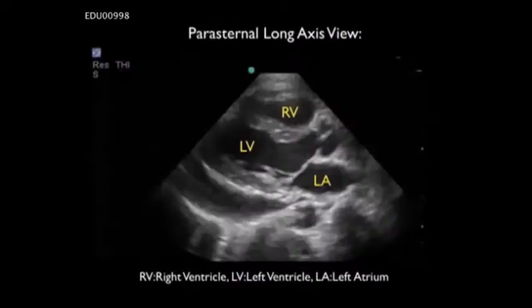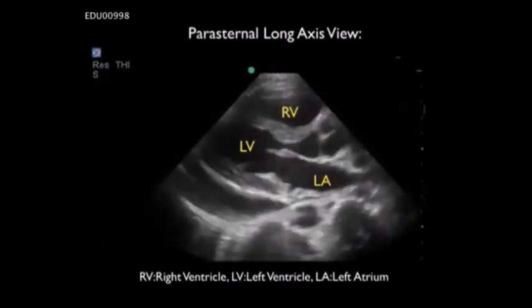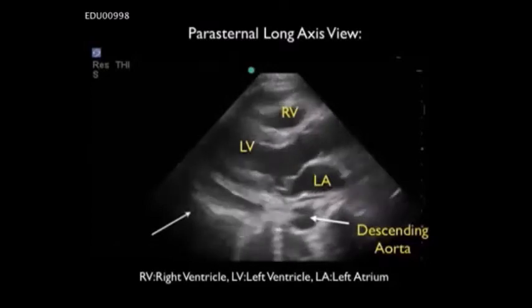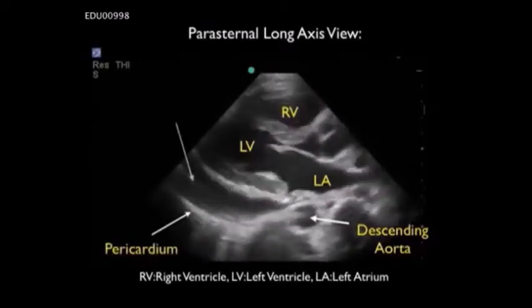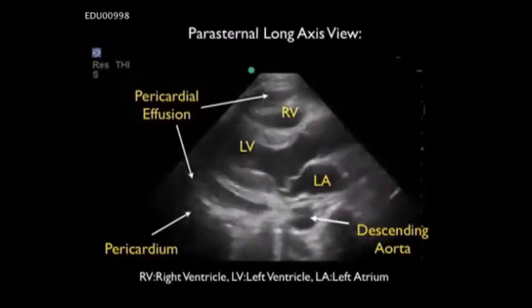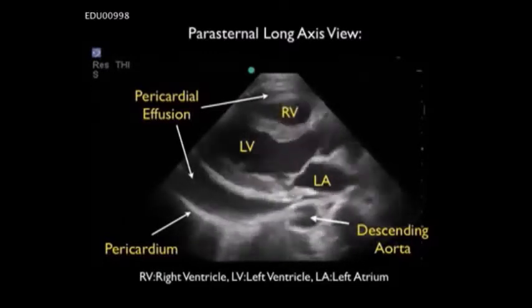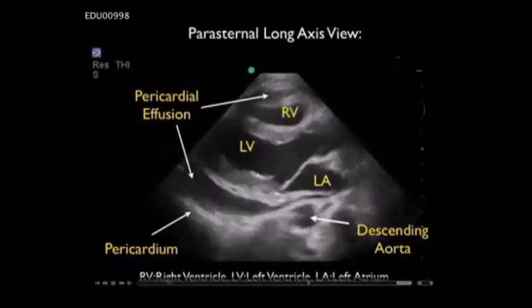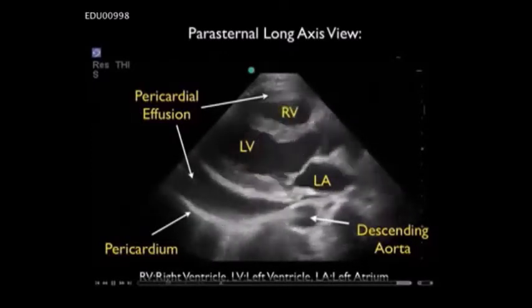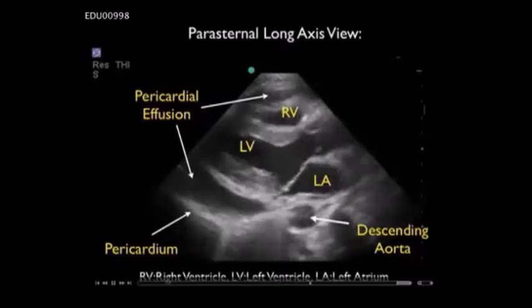Next, we'll take a look at a video, and here again we'll begin by identifying the posterior pericardial reflection and the descending aorta. Notice the descending aorta seen just posterior to the left atrium and the white line that is the pericardium, or the posterior pericardial reflection. And I'll identify that with a small indicator arrow, first tracing the descending aorta and next the posterior pericardial reflection.